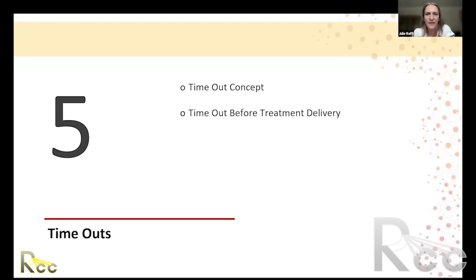When we find a shift, we change the couch position or the patient. That depends. If it's just an automated shift that you can apply with the treatment couch, that would be how it would be done through your IGRT system. But if you noticed a problem with the patient roll, the tilt of their pelvis, or their chin position, you would go in and actually adjust the patient position. In that case, you'd want to reacquire an image again to make sure that their new position is correct.